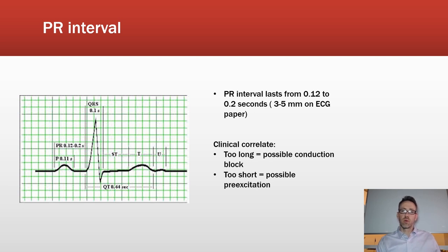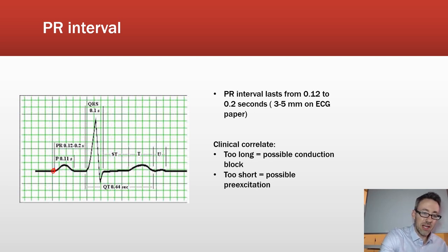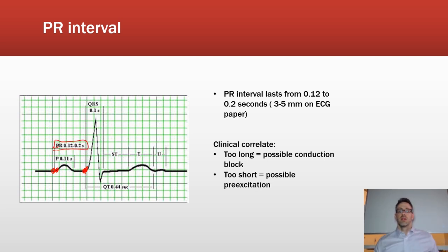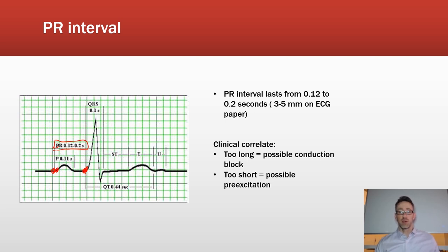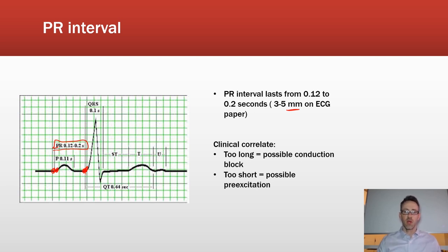Next we look at the PR interval, which is measured from the beginning of the P wave to the start of the QRS complex. The PR interval should be between 0.12 and 0.2 seconds — that's three to five small boxes, or half to one full large box.